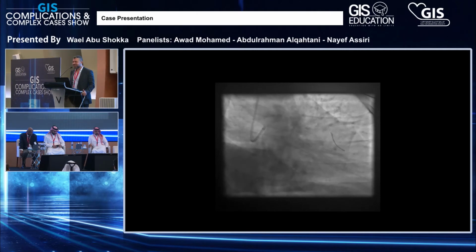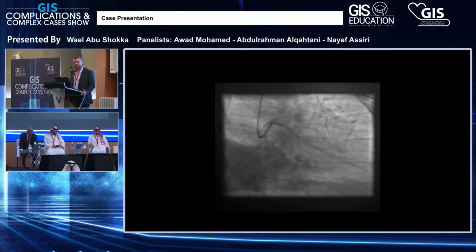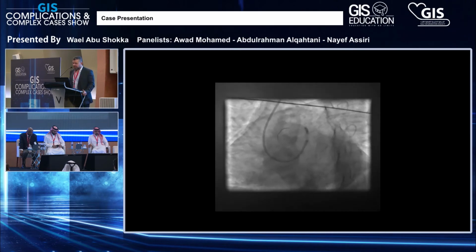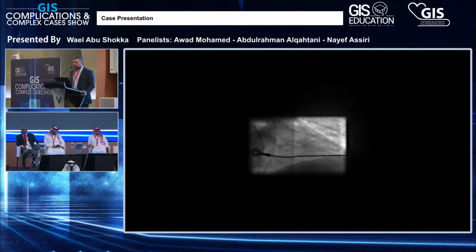I didn't see this coming. How can this happen? We asked the patient, he's taking his medications. We went for balloon dilatation and thrombus aspiration. We knew it was a 3.25 stent. We post-dilated with a 3.5. We wired the diagonals and we had flow in all the side branches.